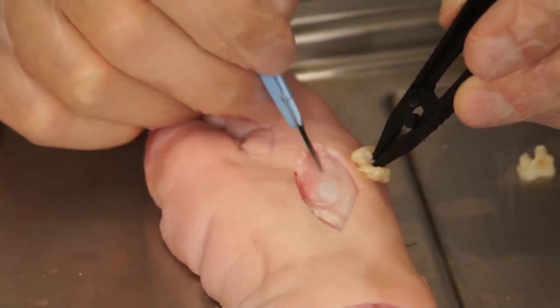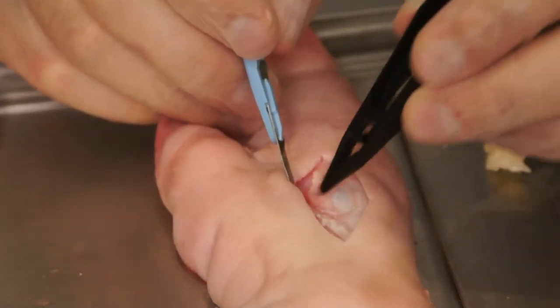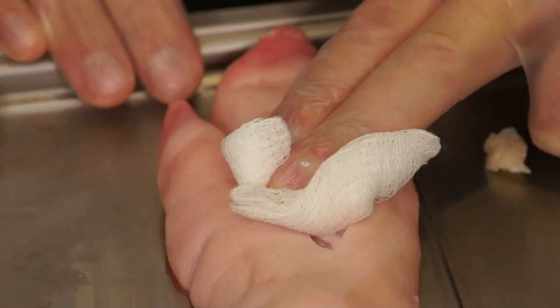If there are tendon or sensitive critical structures within the base of the wound, these can be avoided and carefully debrided around so as to avoid underlying injury.